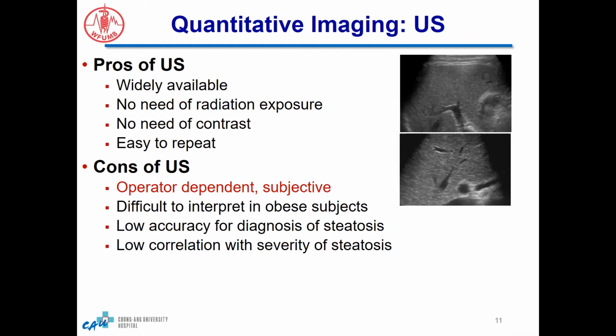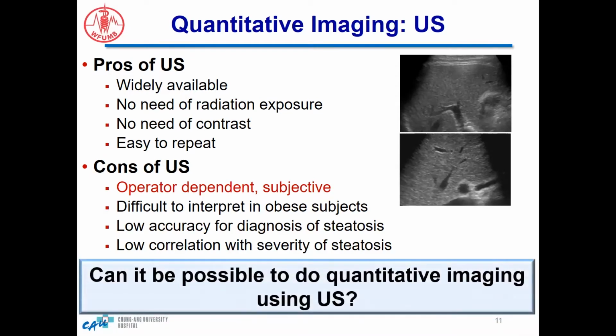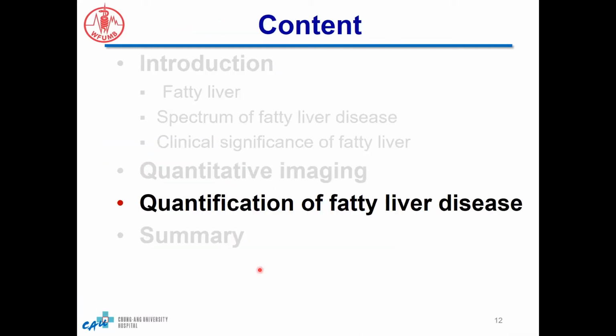The subjective nature means it is hard to quantify. Therefore, the question is, can it be possible to do quantitative imaging using ultrasound? My answer is yes. Let's move on to quantification of fatty liver disease.